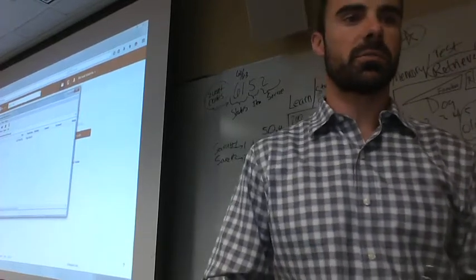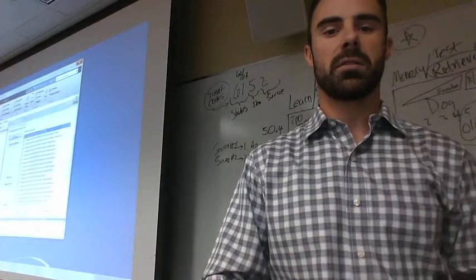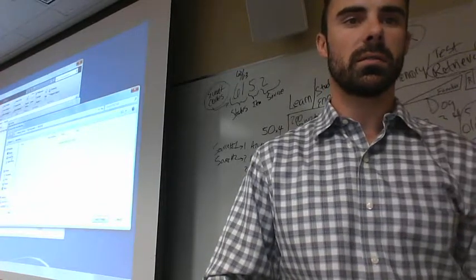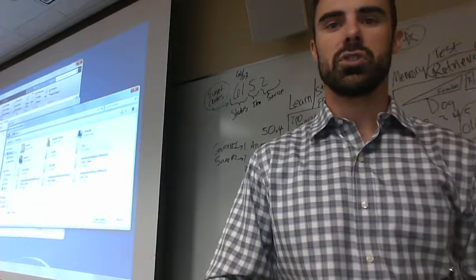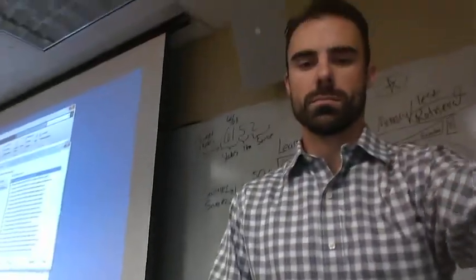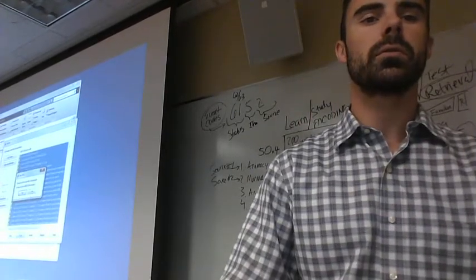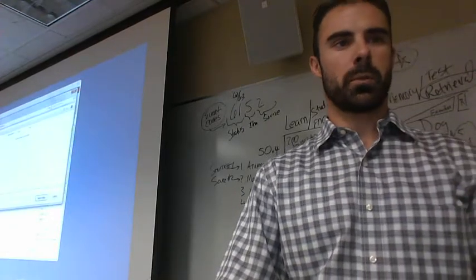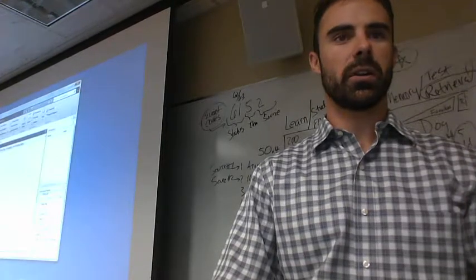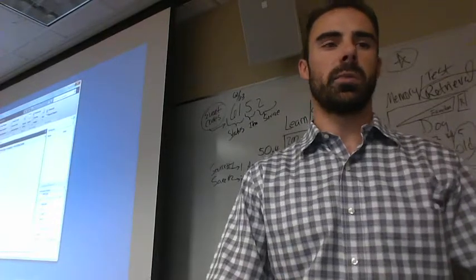All right, let's do some data work. Let's see what we can do here. So everybody should have had this data cooked up and downloaded and all that kind of good stuff. I'm going to set my path just like we've talked about setting. Desktop, EEG. And we set our directory as well. Okay, so I just select folder there, and I have my little shortcut up here for EEGLAB on this button, so I just type that and it opens things up.